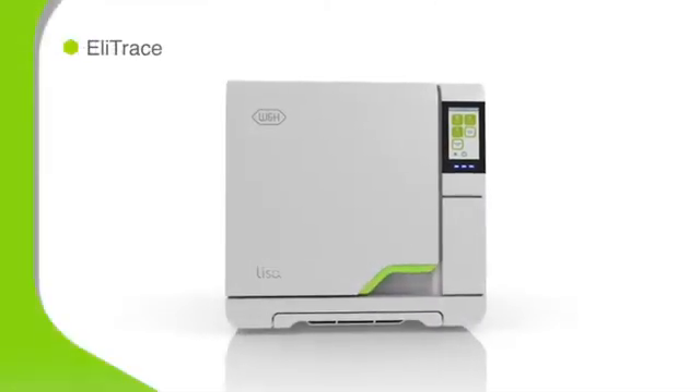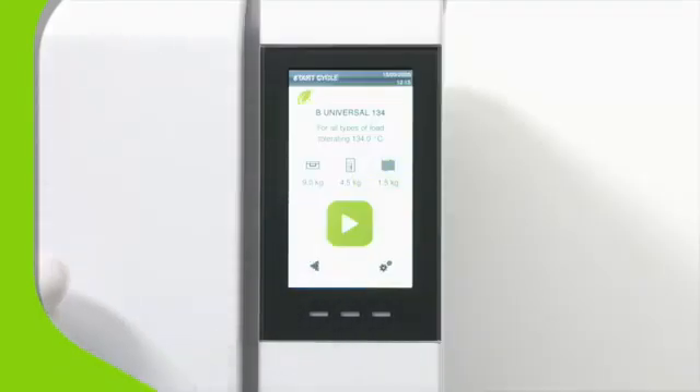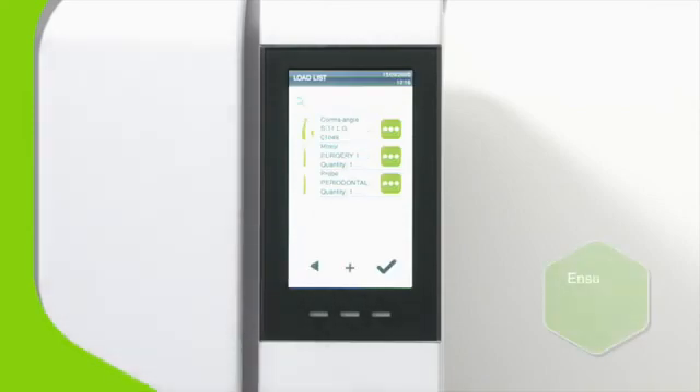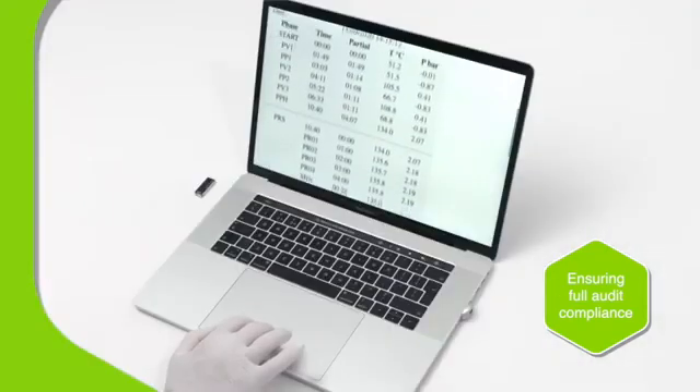Elitrace ensures that a digital trace record is made of each instrument that's vacuum sterilized on one of Lisa's B-type cycles. Cycle records are automatically stored on the integrated USB drive, available to view without any additional software.